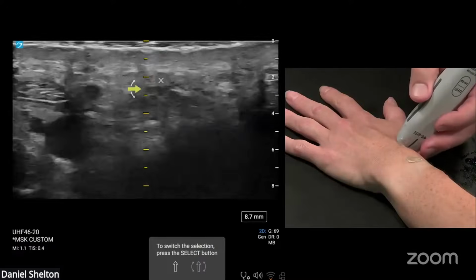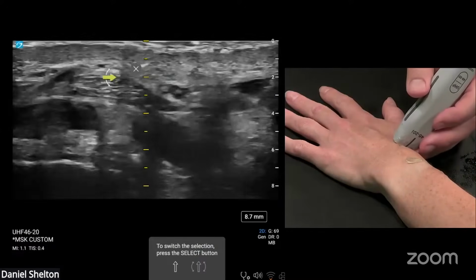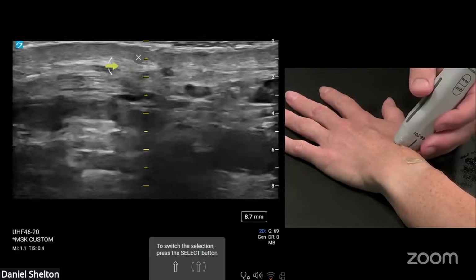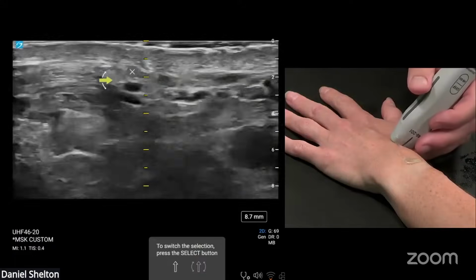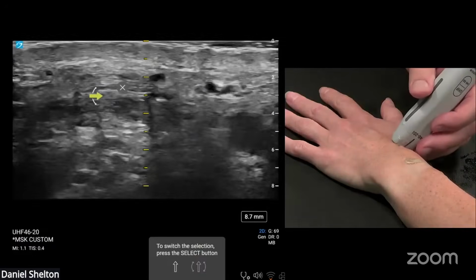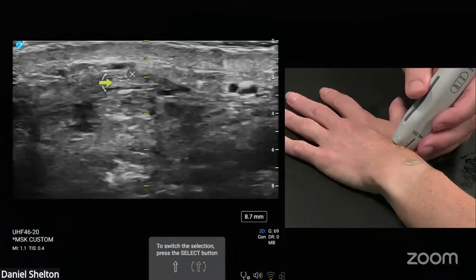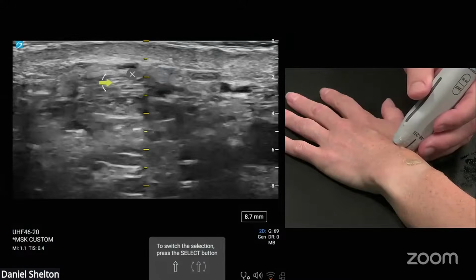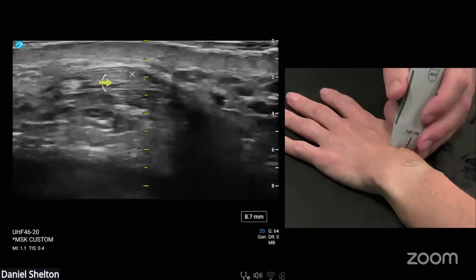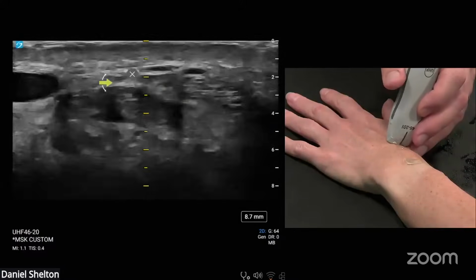If you're doing something like a simple de Quervain's tenosynovitis injection, you might want to avoid hitting the superficial sensory branches of the radial nerve right here. So that's EPL right there sitting over the snuff box. So we can have our model just twitch her thumb, and we can see EPL activate. Nice. A little too much gain on zoom now. There we go. But yeah, that's her EPL, and you can see all those little nerve branches sitting on top right there.